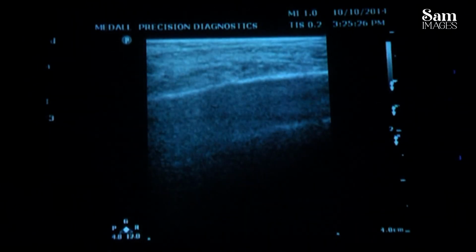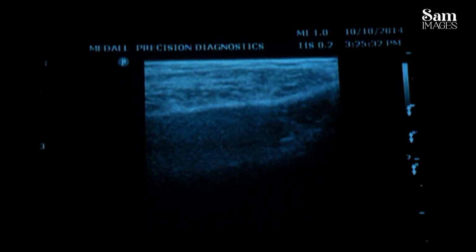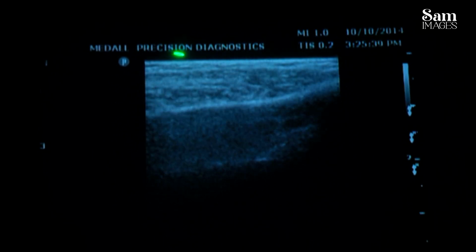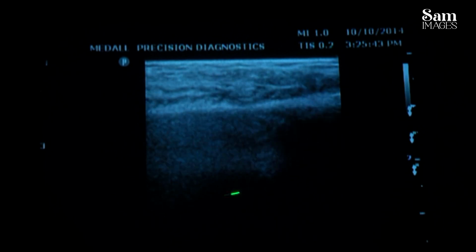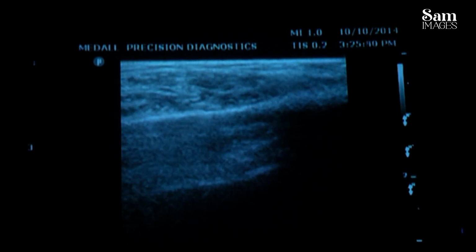Beautifully explained: skin, subcutaneous plane, and the muscle, down is the muscle, and the bone. Beyond the bone, because all sound will get absorbed by the bone, nothing will be seen. So that is typical of the normal one, and that is the mandible bone. Okay, dual.